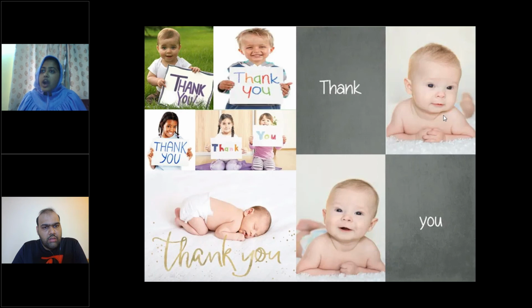But usually we are actually giving a near target, because it's very difficult for us to keep a very small child looking at distance. So usually what I used to do in my fellowship times, and which I do right now also, I give a target at least 1 meter or 2 meters. So, knowing the proximity, we are always just doing the near vision. So it is very recommended that we write at what distance the target was given, like did retinoscopy using a target at 1 meter or 2 meters.